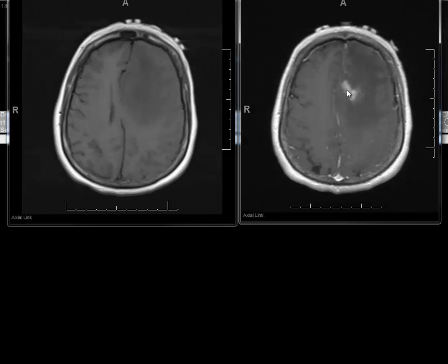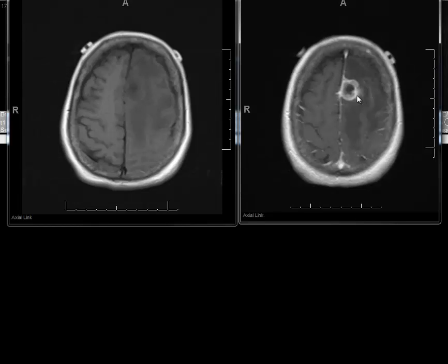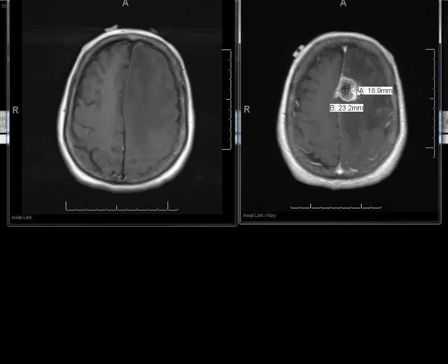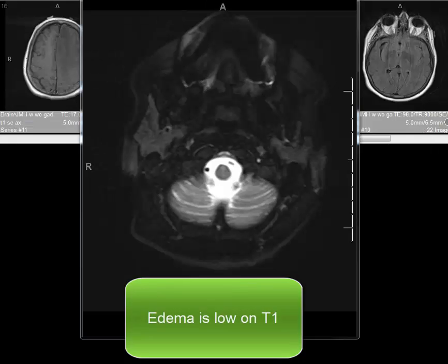Here we have a lesion that is enhancing, so you can see that it is taking up the contrast material. All of this low signal area here is edema, and edema looks low on T1-weighted images. This sequence has a short TR and a short TE value.